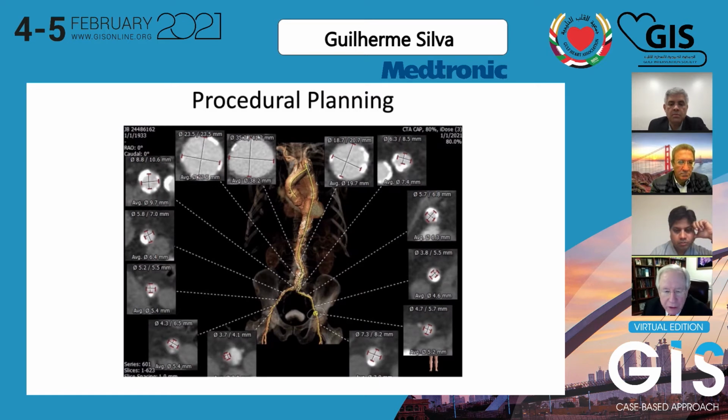Most of the sheaths place us above the infrarenal abdominal aorta, so we're not traversing that area a great deal through these procedures. And they're certainly not great candidates to do anything to that aneurysm until the valve situation is straightened out. This particular patient at this age, we would have just observed it anyway. But from a technical standpoint, it really is not an impediment to getting the sheaths and the wires, et cetera, through this area safely.